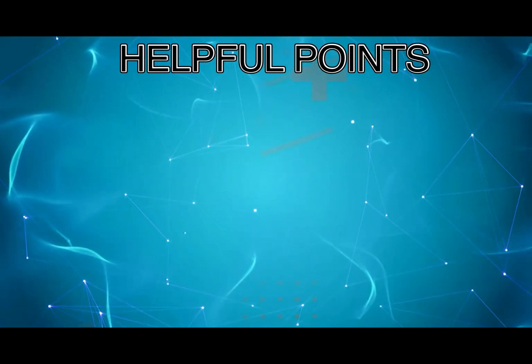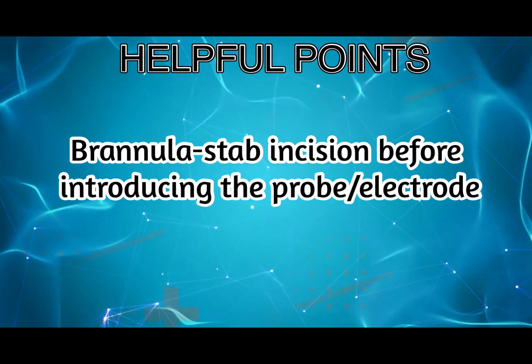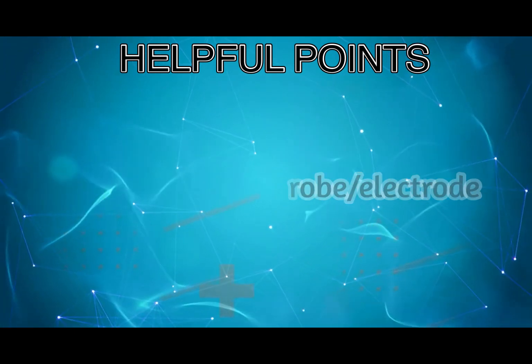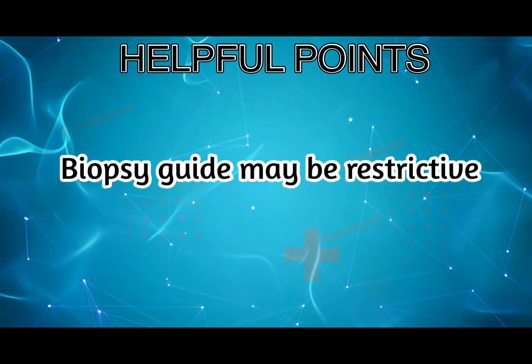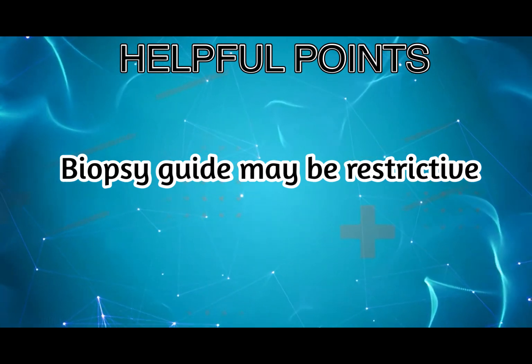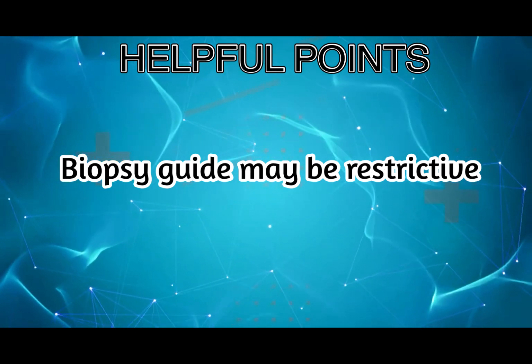Here are some things which I think are helpful for the initial learner. Use a branula rather than a blade for stab incision, especially if a biopsy guide is used. I also find that using the biopsy guide is only helpful during the initial entry to prepare a trajectory, as it may be restrictive when finer adjustments are needed when you approach the fetus. Be prepared to remove it to allow free hand movement.